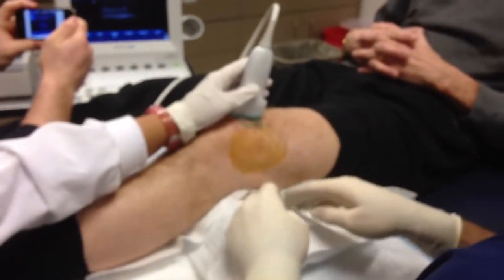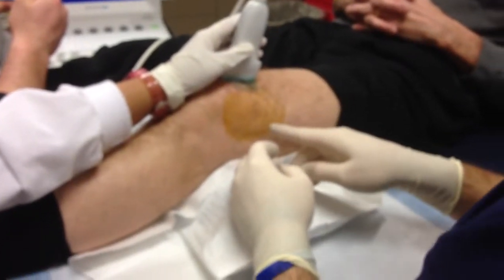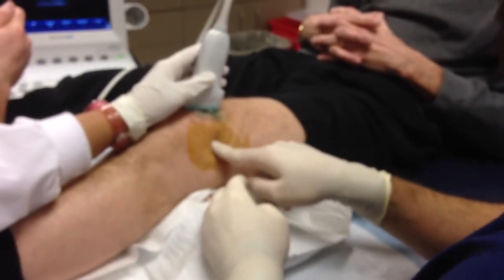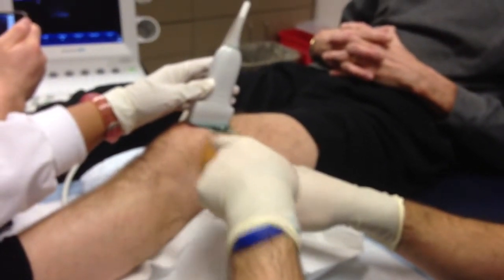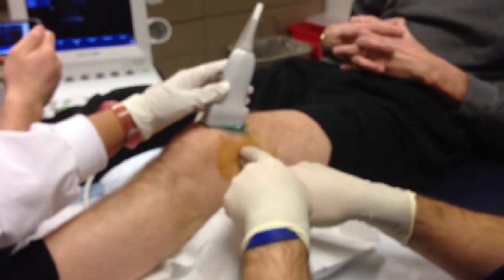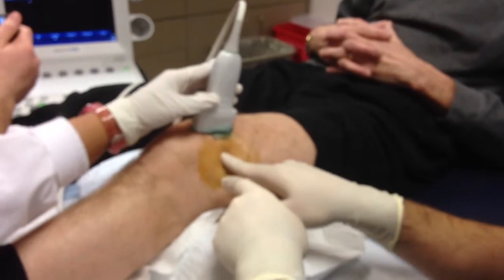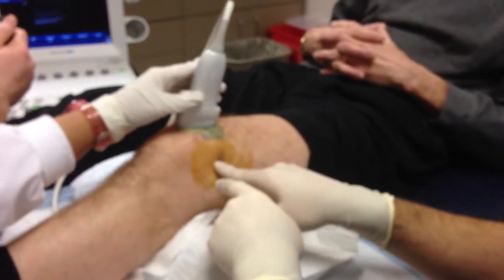We're going to be doing an injection into the capsule of the knee for viscosupplementation. I just want to show you the anatomy right here. There's a soft spot right here — just proximal to the kneecap. There's a soft spot posterior to the iliotibial band, and the lateral head of the quad is right here. Right in between there's a nice little soft spot. I've previously marked that.